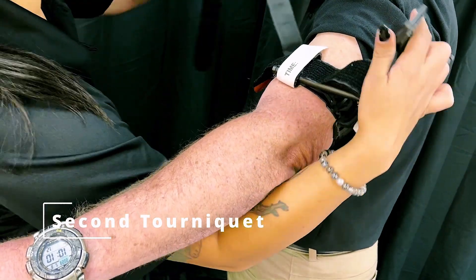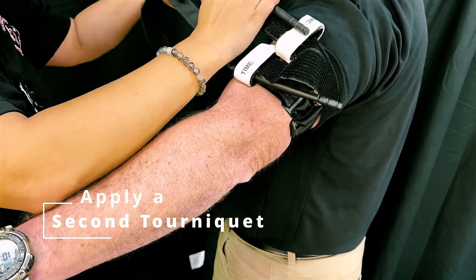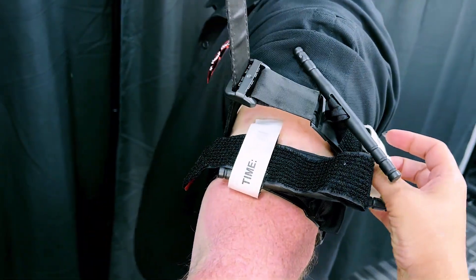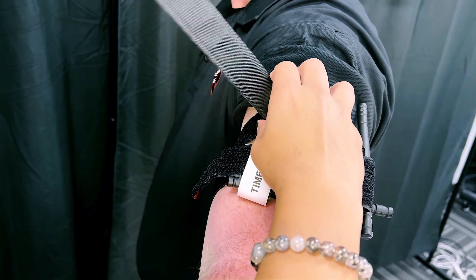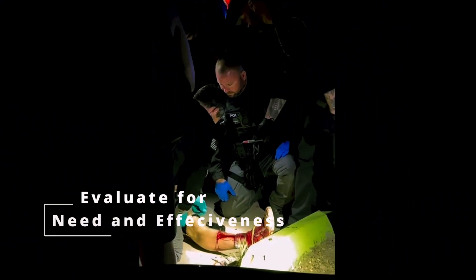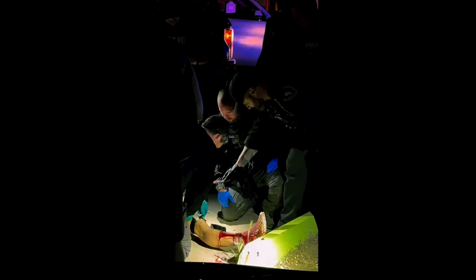If the tourniquet is properly placed and fails to control bleeding, apply a second one directly above the first. Route the second CAT in the opposite direction relative to the first tourniquet. If a non-credentialed provider, such as law enforcement or a bystander, has placed a tourniquet, assess the need for it and confirm appropriate placement.